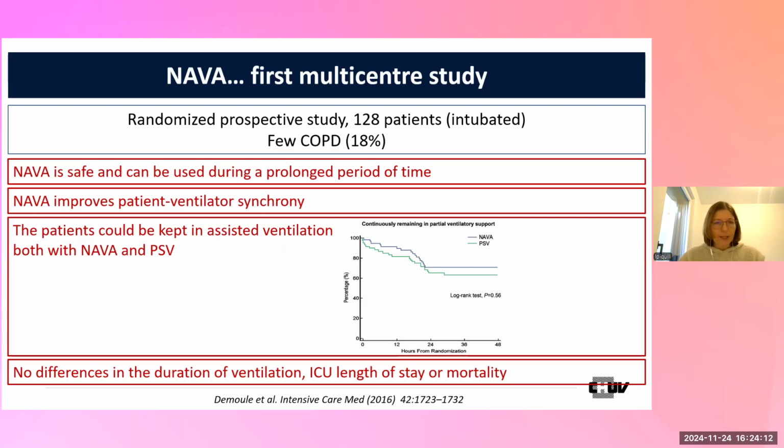Then first, this is the first randomized multicenter study performed with NAVA, already a long time ago, nearly 10 years now. 128 intubated patients were included, and these were a general patient population in the ICU with very few COPD, less than 20%.